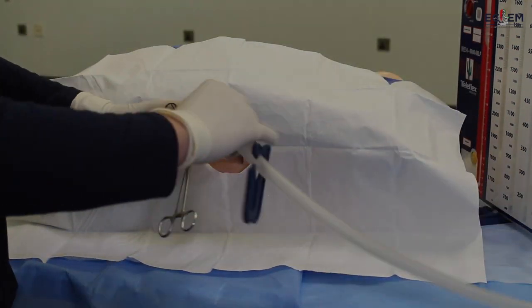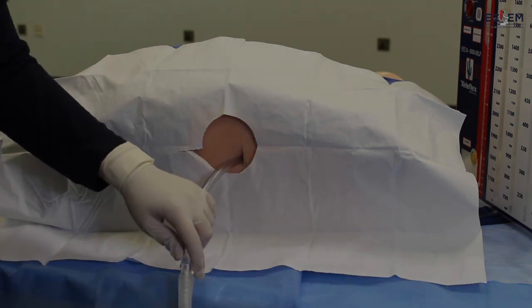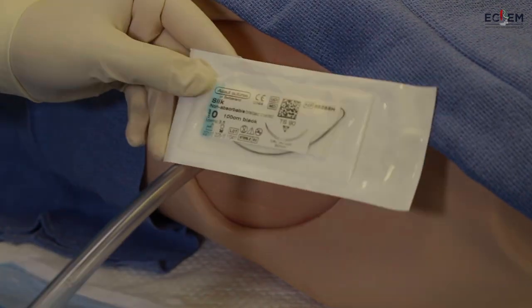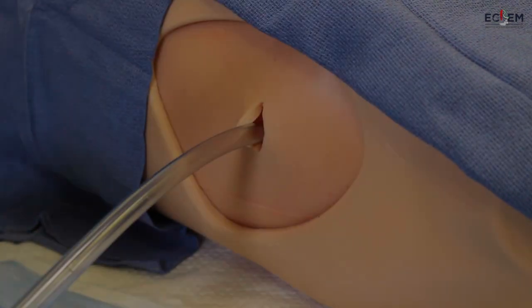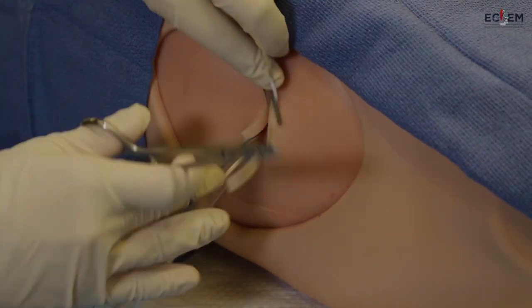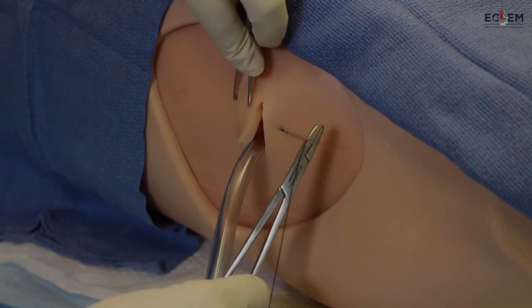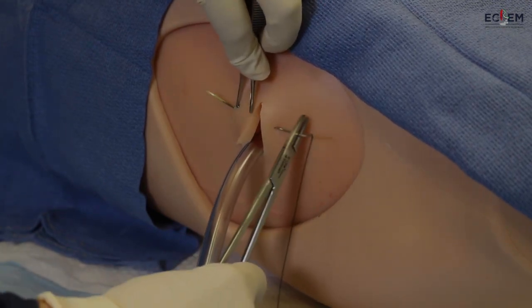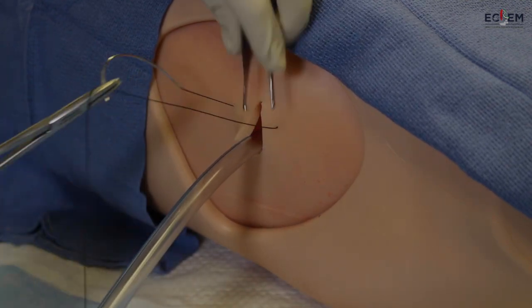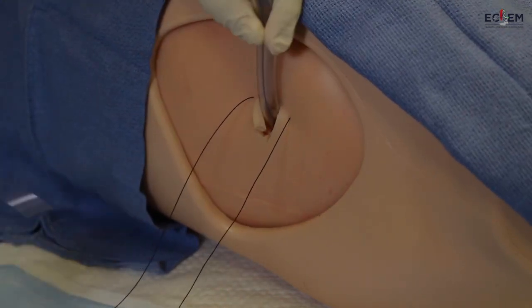Now connect the tube to the water seal — the water seal will be placed on the floor — and remove the clamp. For securing the tube, prepare a suture in a horizontal mattress fashion. Push the tube down so we do not penetrate it. I prefer using the Soweto tie as it holds the tube best in my opinion.